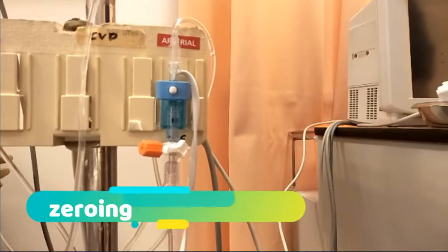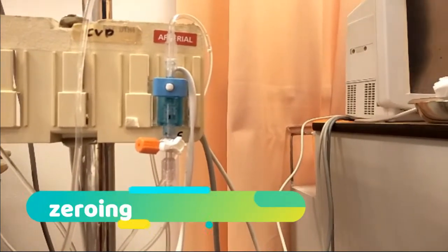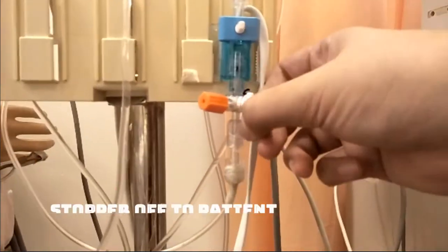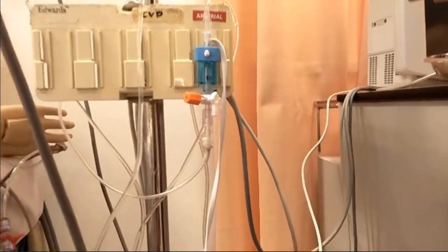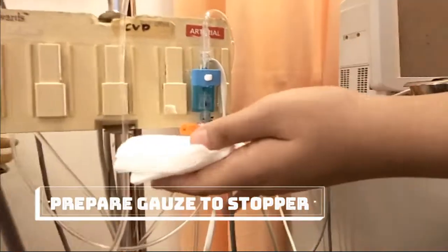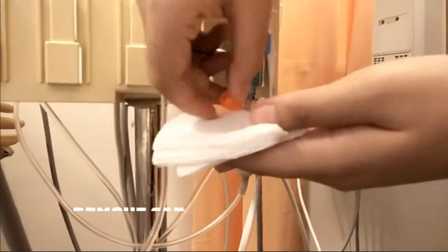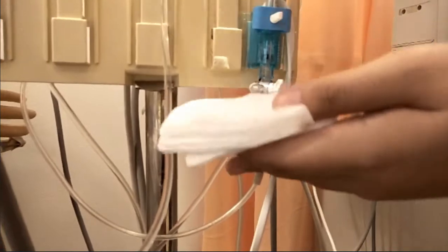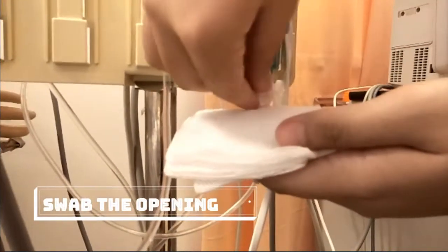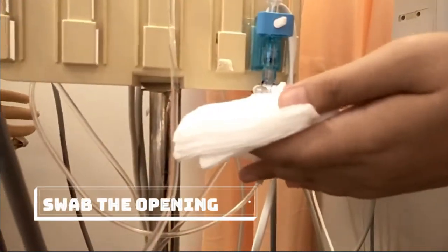Now, for the zeroing procedure, first turn the stopcock off to patient. Then, prepare the gauze to the stopper and then remove the cap. Get an alcohol swab to swab the surrounding of the tube.